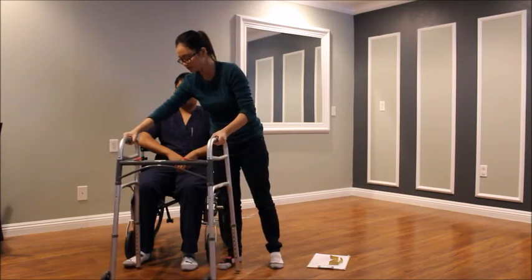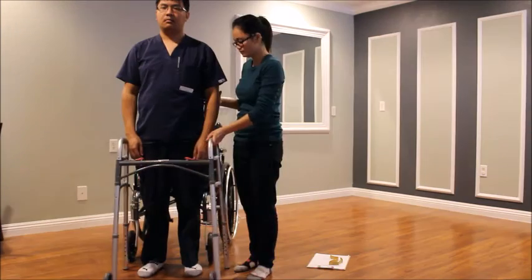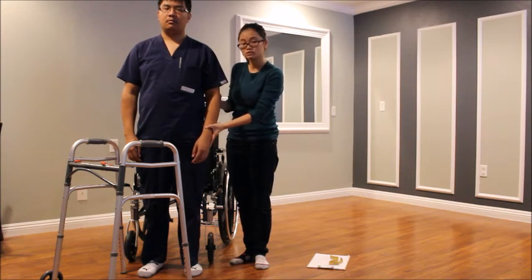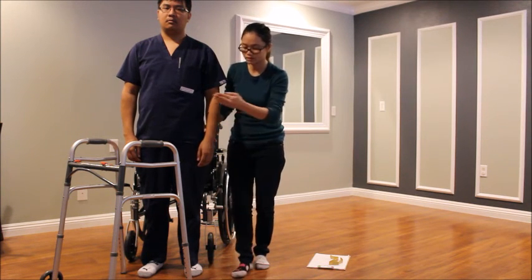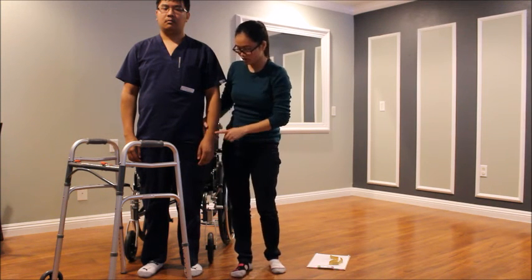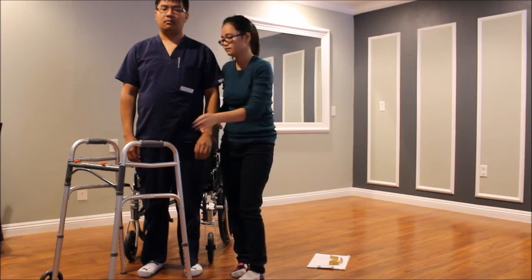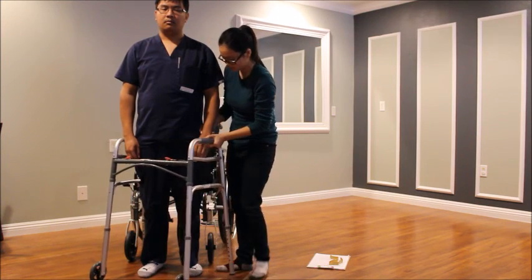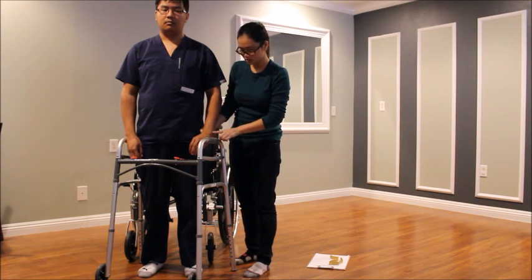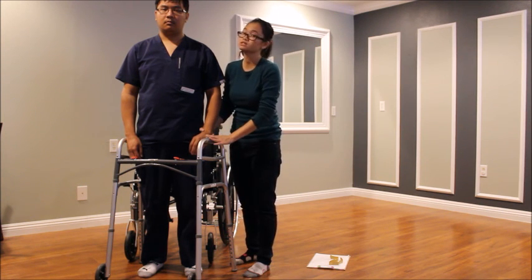So now I have him stand up in order to measure. Okay, have the elbow flexed a little, 20 to 30 degrees. And you measure from the bottom of the cane or the walker all the way to the styloid process or the wrist area. Okay. So you can see here it matches his wrist to the top of the walker right here. So this one is a good height for him.